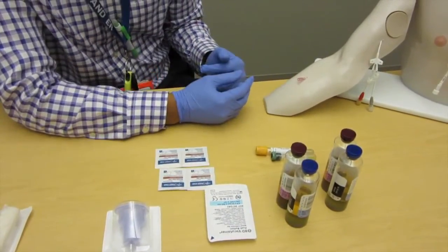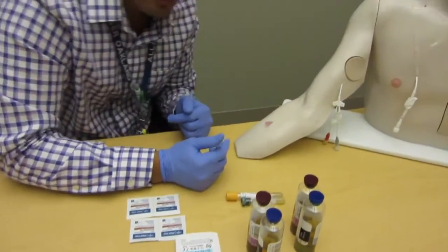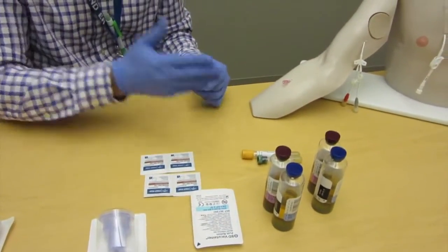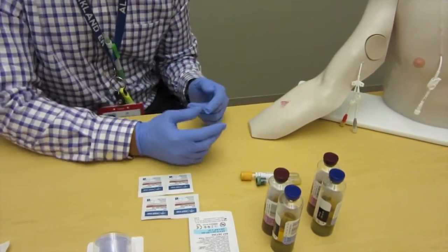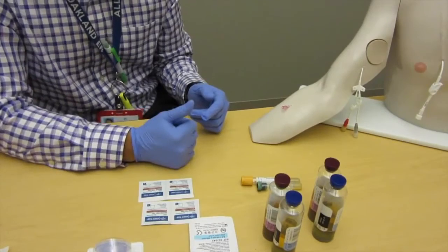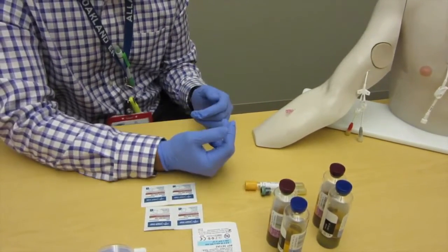Here's improper technique number two: do not do this. Once you scrub it for 30 seconds, you're supposed to let it dry for 30 seconds. You don't want to blow, you don't want to fan, because then you're introducing bacteria right on the area that you just scrubbed.